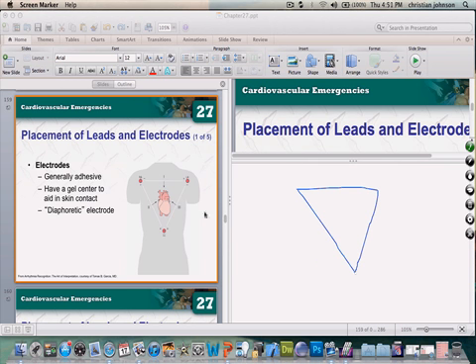If you look at this diagram, you're going to have a lead 1 direction. Lead 1 always goes from right arm to left arm. One concept to keep in mind when reading EKGs is that electricity is always going to flow from negative to positive. That's how the EKG is going to read it. So when you have a test question that says, where's the negative electrode in lead 1, your answer should always be right arm. Lead 1 goes negative to positive, from right arm to left arm.